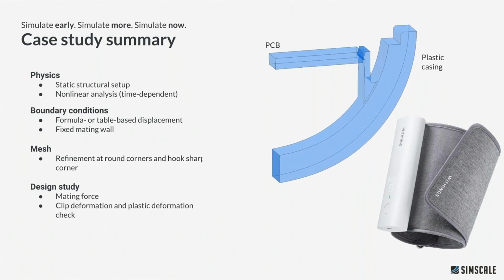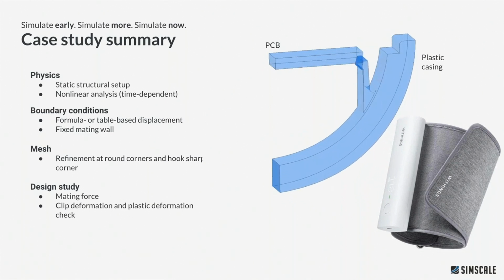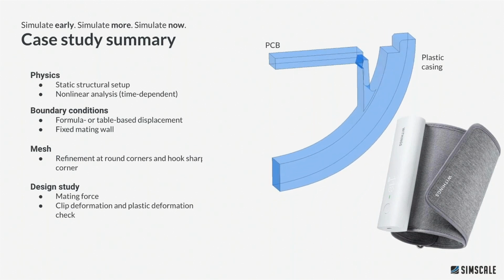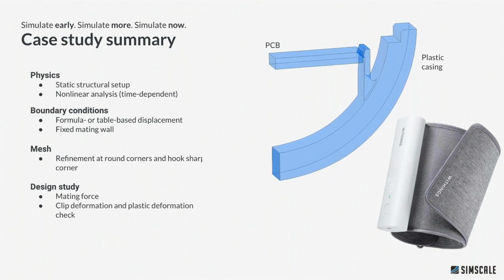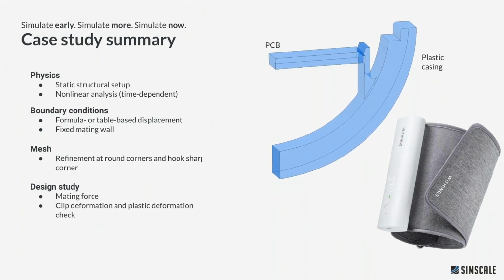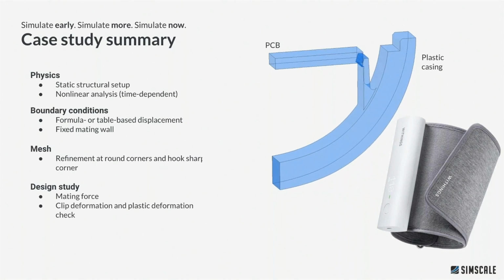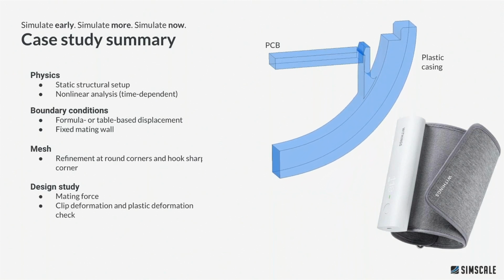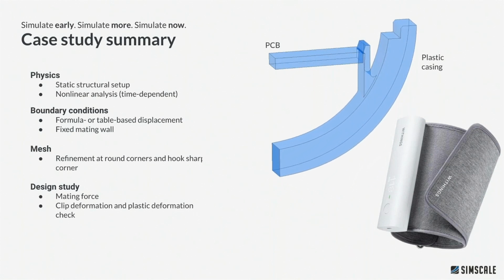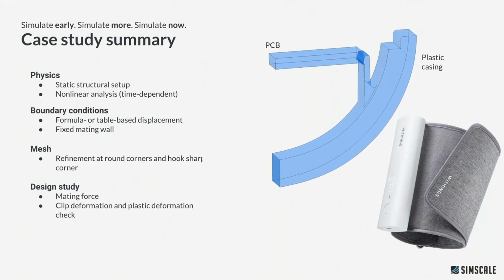The corners are going to be refined in the mesh to allow for precise calculations because, as you may see, we have some sharp corners, some radius at the base of the clip. And this is a very important step for mechanical simulation. Finally, at the end of the simulation, we'll be able to obtain the mating force of this joint, as well as to check if the deformation is acceptable for the chosen material. That is, if it's still in the elastic region of this material.